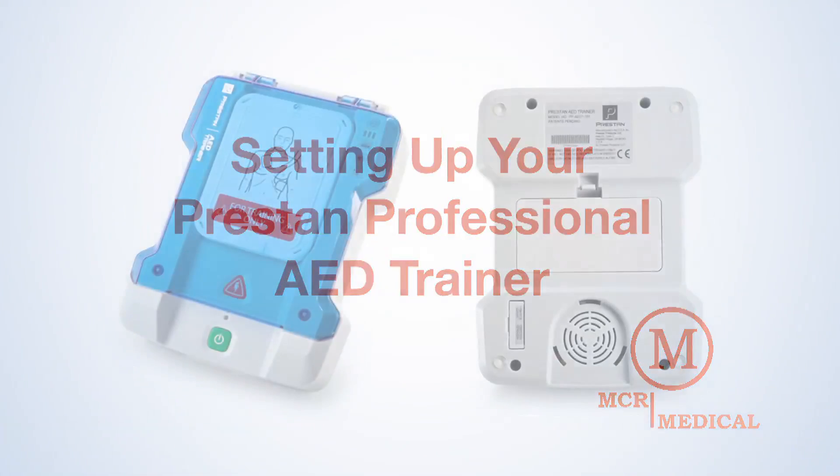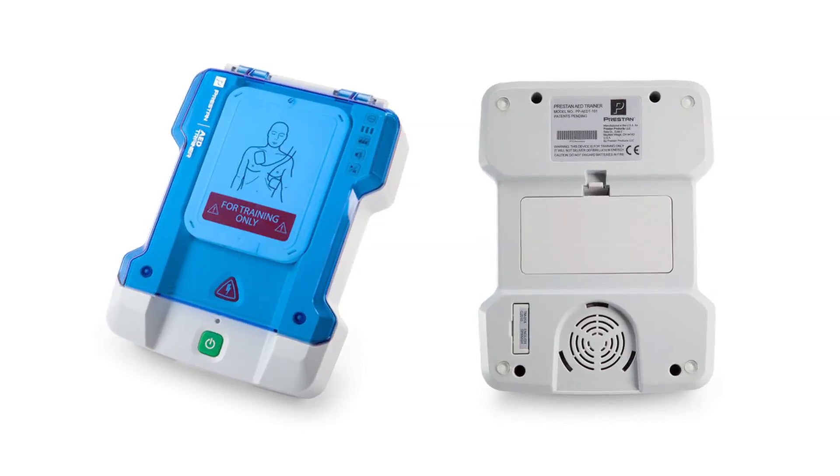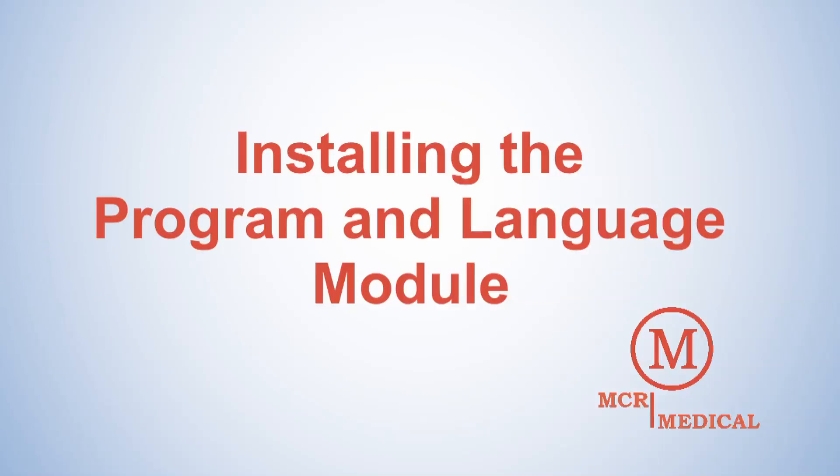How to set up your Prestan Professional AED Trainer. First, we'll be installing the program and language module.